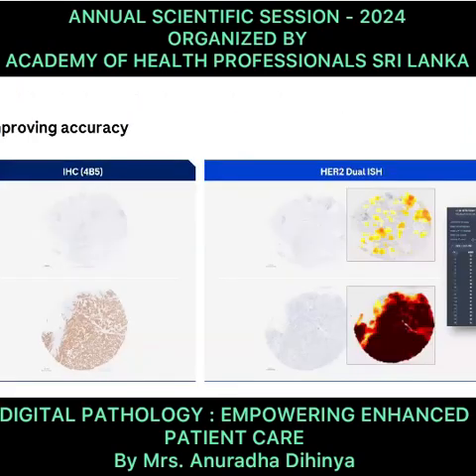Now, talking about improving the accuracy. There is now HER2 low, which has come into the picture, where there is a cutoff percentage when you're scoring HER2 low and ultra low, especially with 1+. When you're doing it, the algorithm actually helps the pathologist to focus on those areas and to give the appropriate score.